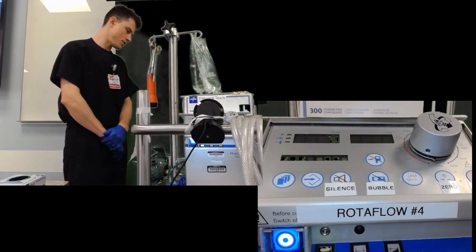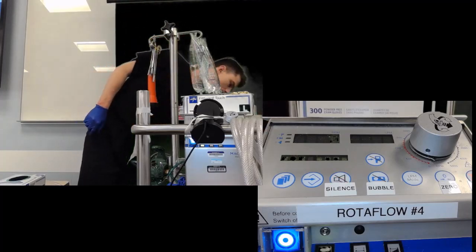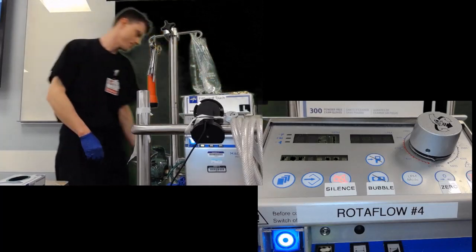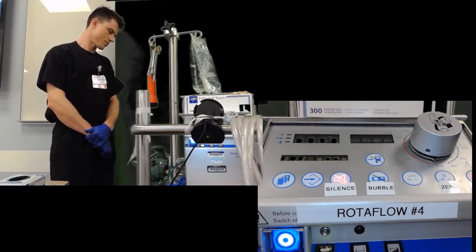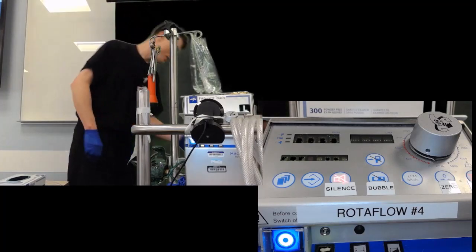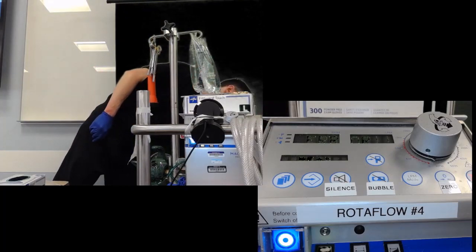So undo that, and then just put it on right here, you pop it out. Yeah, it has to go under, unfortunately. There's a little lip there, make sure it engages in the lip first. There you go.